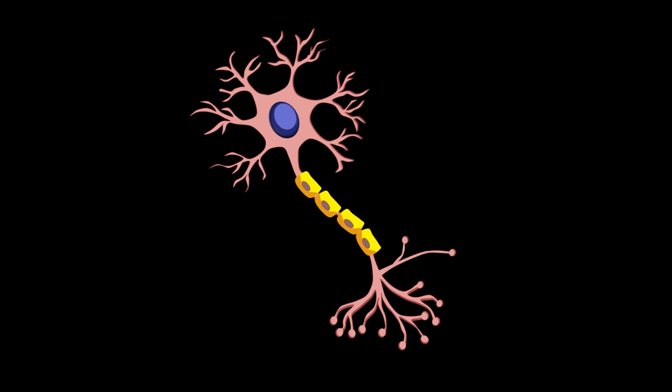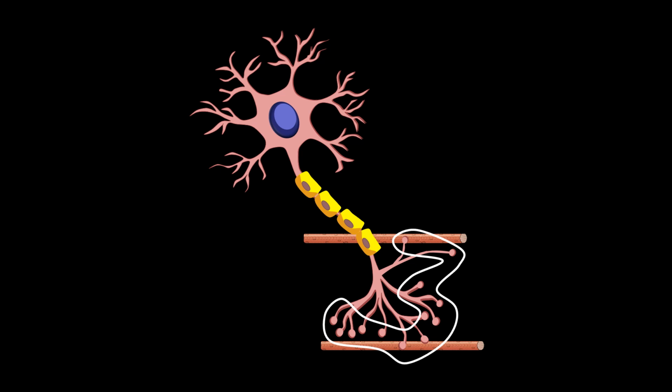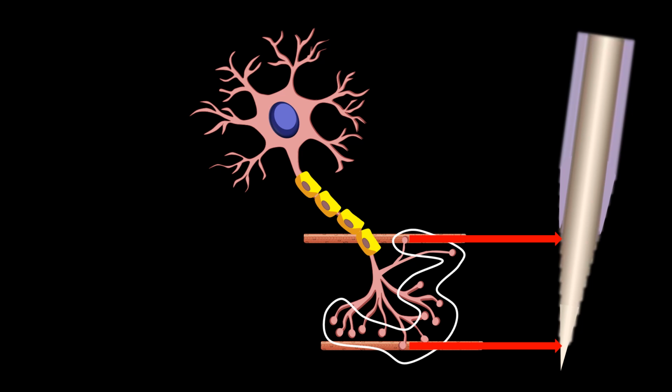This is the same cartoon that I showed you initially, but now I will use it for a different explanation. Let's go back to the lower motor neuron with the delineated end plate zone and add two additional muscle fibers. These fibers have the distinction of being innervated by the two synaptic knobs that are furthest apart in the perpendicular plane of the muscle fibers. Notice that they are about as far apart as the two furthest synaptic knobs in the plane of the muscle fiber. Yet, as you can see, they are equidistant from the recording surface of the needle.